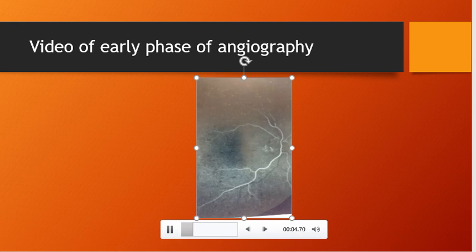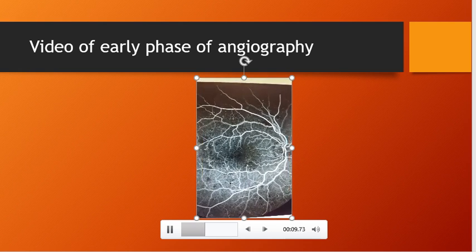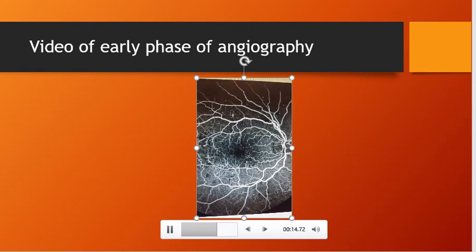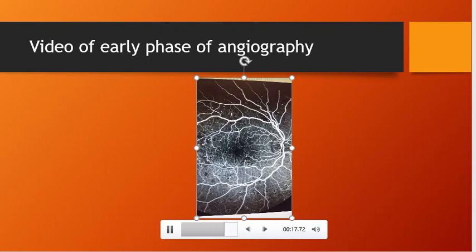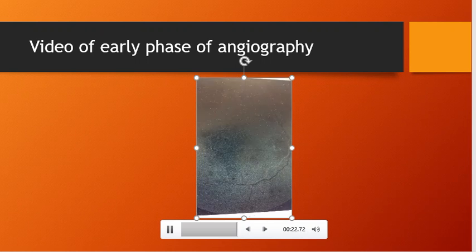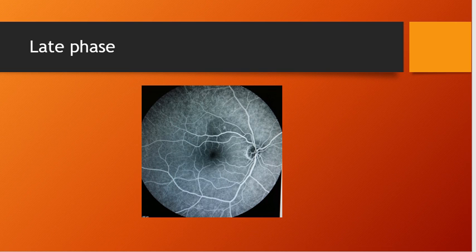In the early phase of the angiogram, blood vessels have started filling up. Some white spots visible here represent an abnormal fluorescein angiogram from a diabetic patient — those are leaking spots or microaneurysms. The early phase lasts about 15 to 20 seconds. The last image shown is the late or elimination phase, where the dye starts being eliminated from the retinal circulation, taking about 10 to 15 minutes.